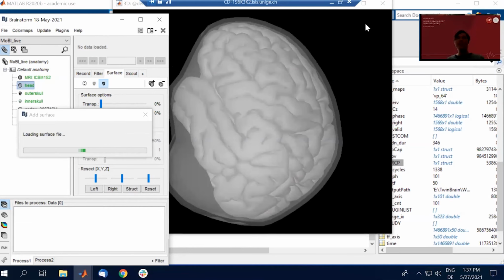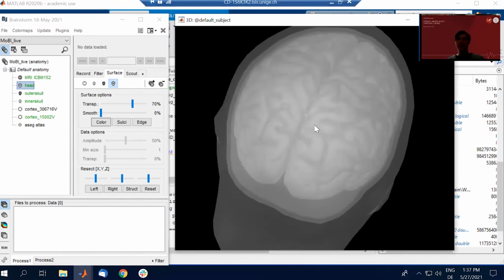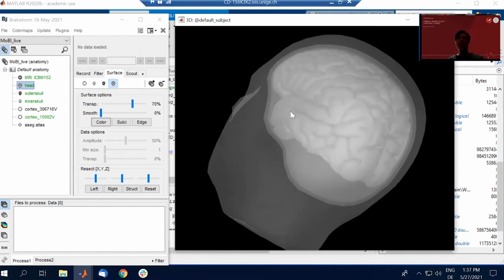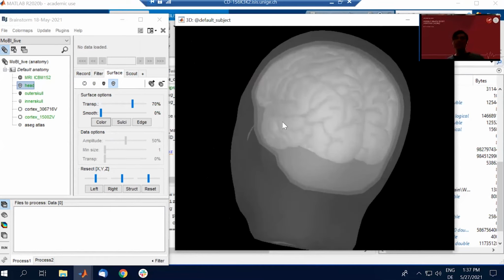And hopefully you can already guess where this is going now, because we have this model already done, we know where the brain is in comparison to the head. So what is missing are the electrodes. Meaning this is all coming with the toolbox. There is no specific information yet, but we're going to add it. So all this anatomical information is already there.